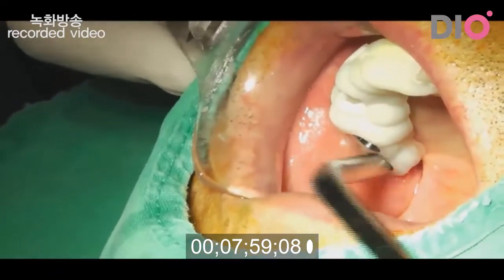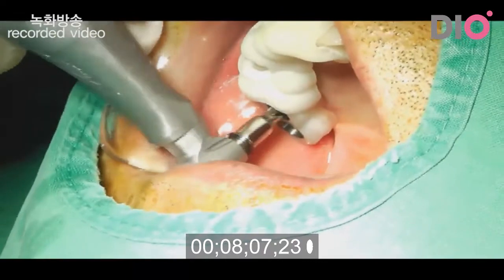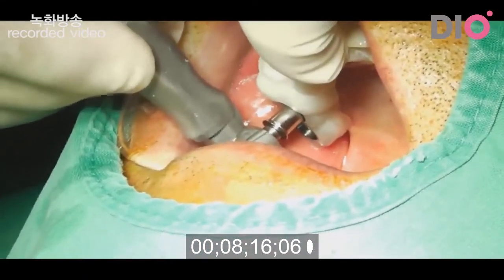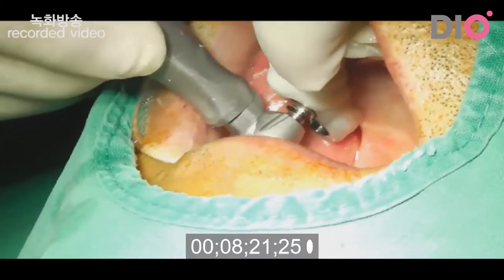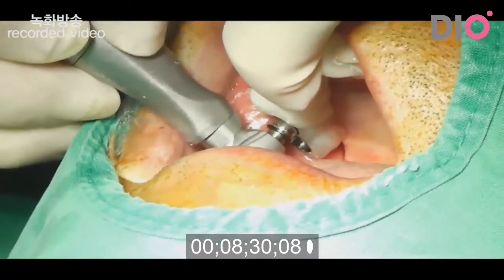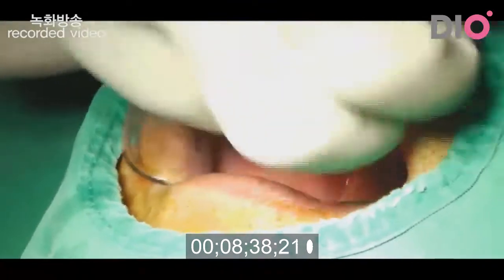Then, this is also the sinus drill. I will drill into the sinus cavity 1 millimeter deeper than the depth of the final drill. That's it.